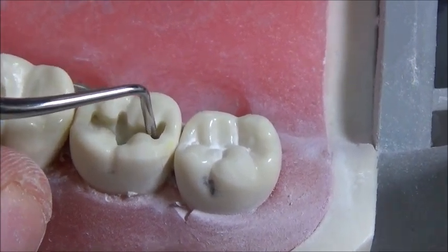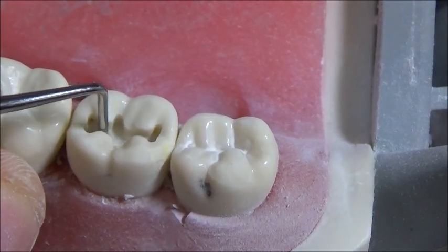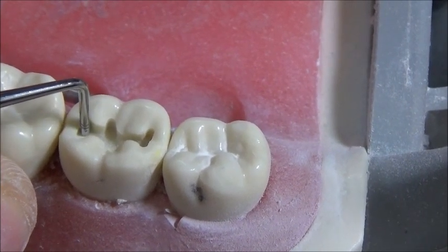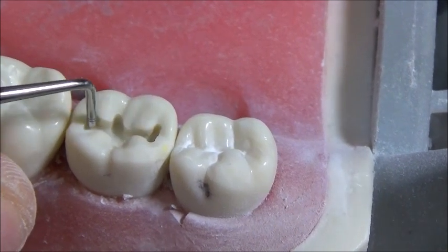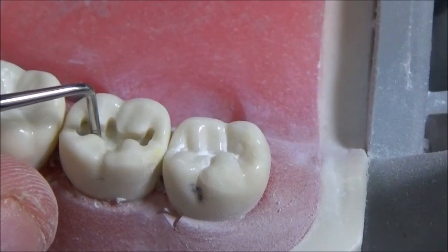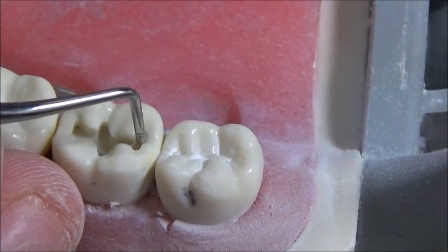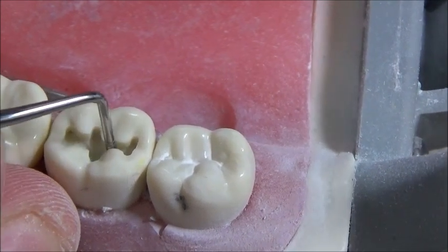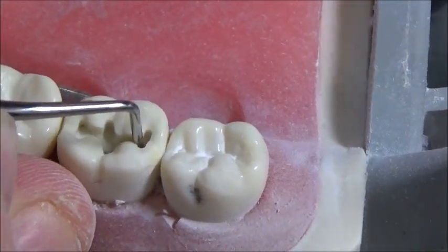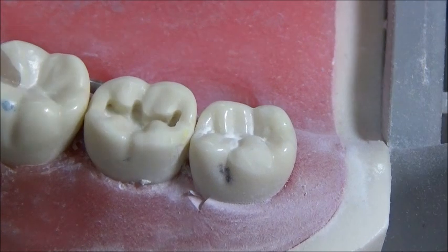That's right about 1.5, that's about 1.75, about 2 there, and 1.5. This is particularly important whenever you're working on the mesial and distal part of the tooth — we tend to make things a little bit shallow there. If you can't fit the instrument into an area, that's how you know you need to open up a little bit more. The width diameter of this instrument is about 1mm, so we need to open up a little bit more there.